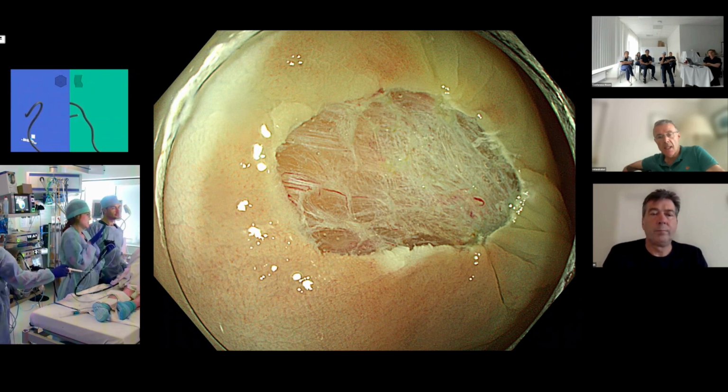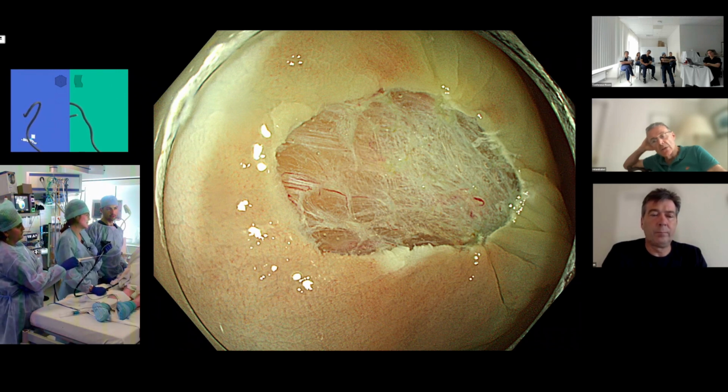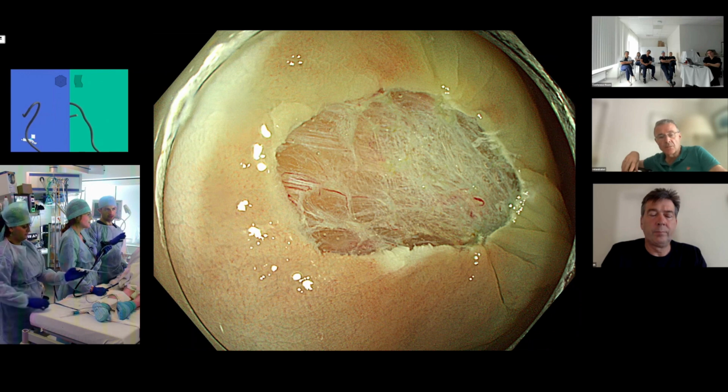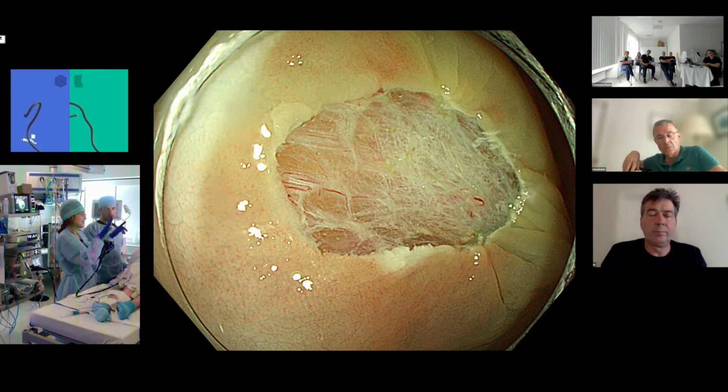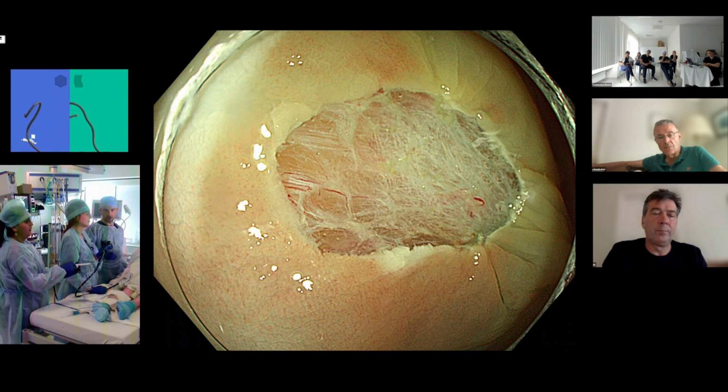No, because the mucosa seems intact, she says. So I think perforation risk for the bleeding, I'm not 100% sure, but I think it's okay. Well, there's no visible bleeding, is there? We've paused it, but whatever, that's fine. You said the mucosa is intact, but you meant the muscle is intact. The muscle, yeah. So the muscle looks like it's intact because you don't see it. So we don't see any muscle here, really. So that's great. And the margin is intact in terms of adenoma. Yes. You've just proven that.